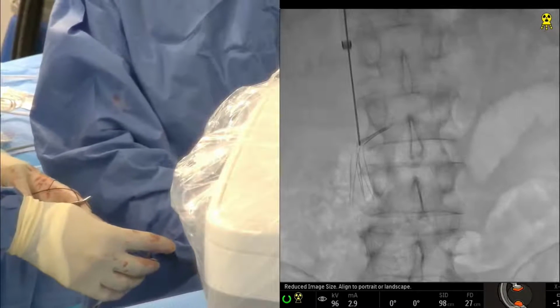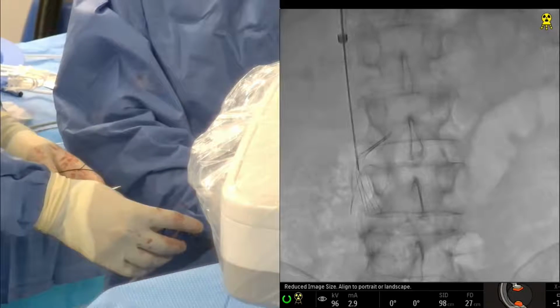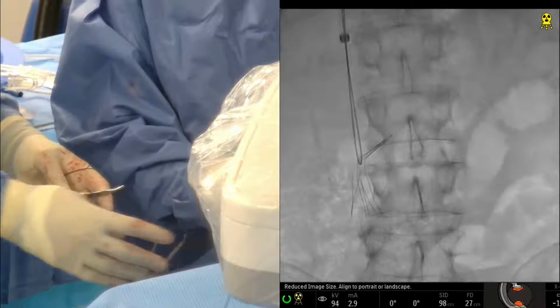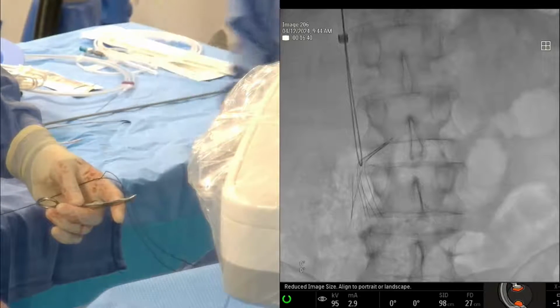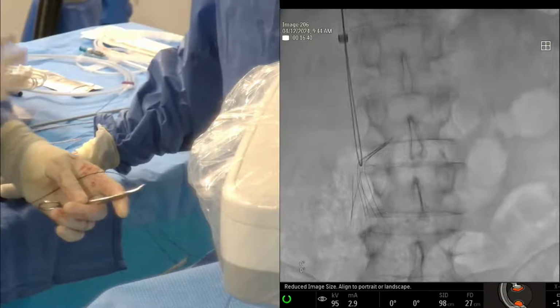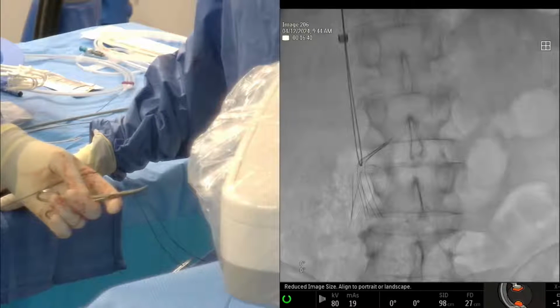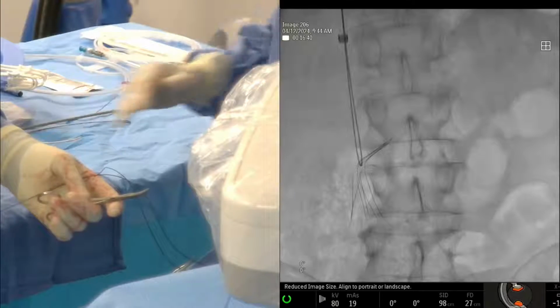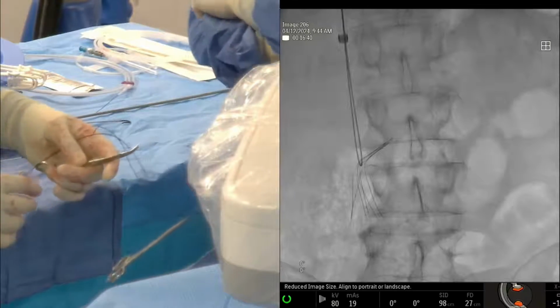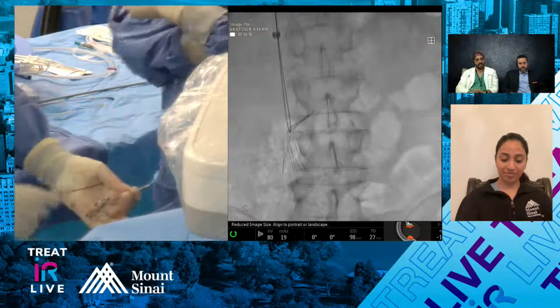Okay. See, this is the thing with it. It's embedded. We've created a horizontal platform, just like you were saying earlier, Rahul. It's horizontal. Yeah, it's a little hard to predict. Sometimes, like I said, it's hard to predict exactly which way that thing is going to cantilever and turn, right?